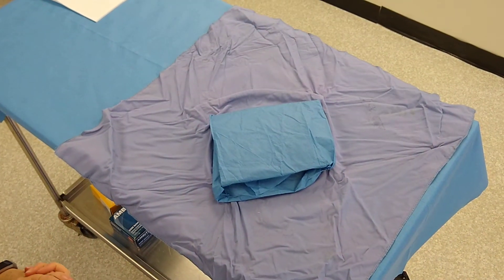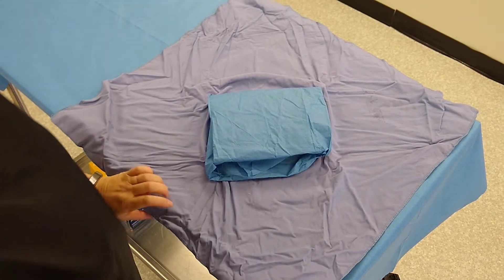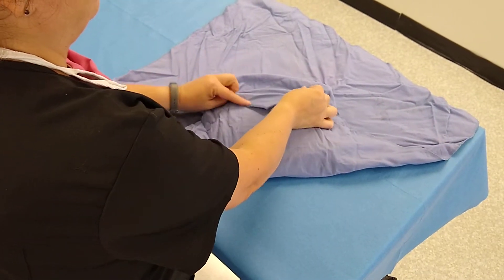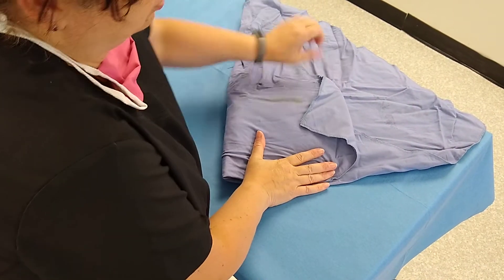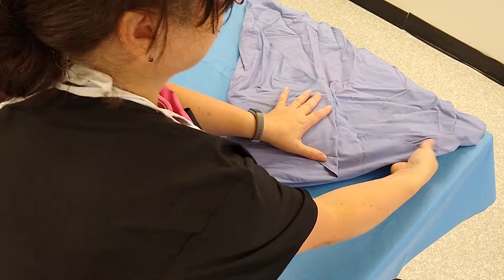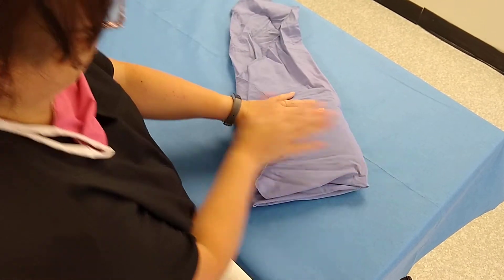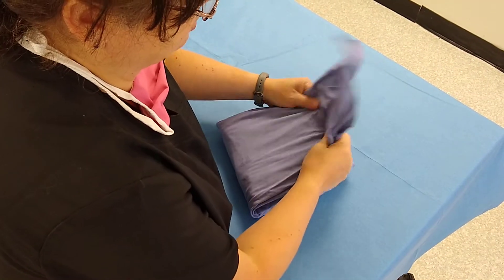For your outer wrap, repeat the same process. The bottom edge goes up. Make sure this one is snug as well. Bring this edge over, then take your top flap, bring it up and over, and tuck it into the cave.